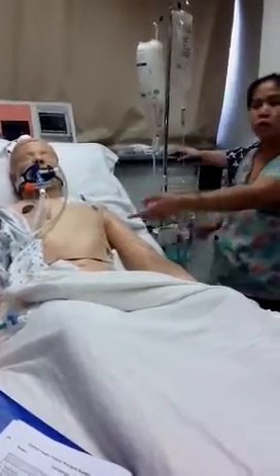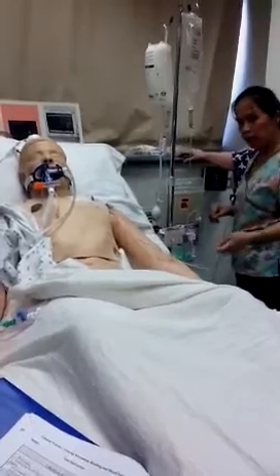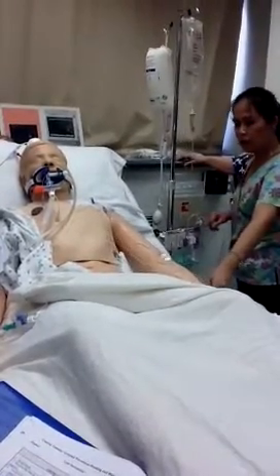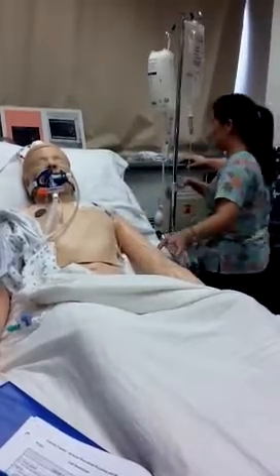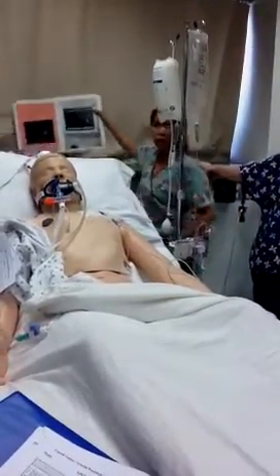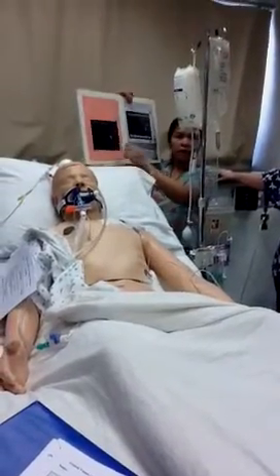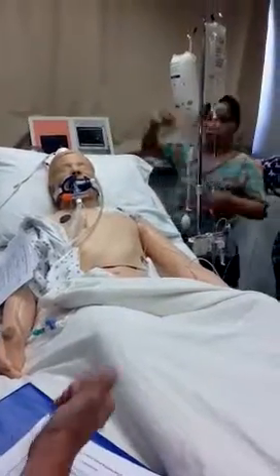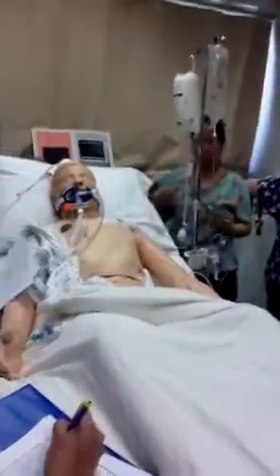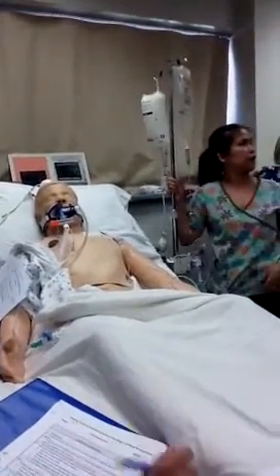The same thing we would do with this is, at the beginning, we will go ahead and do the level of the zeroing, and this is the yellow one. And it's always going to be the yellow, the red, so this is the standardization, universal. Okay? Do you guys know what a normal CVP is? Oh, we just learned. Very, very low, but for critical care, 0 to 10. 4 on there, yeah, very low.